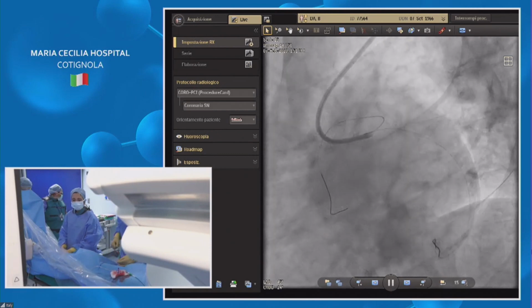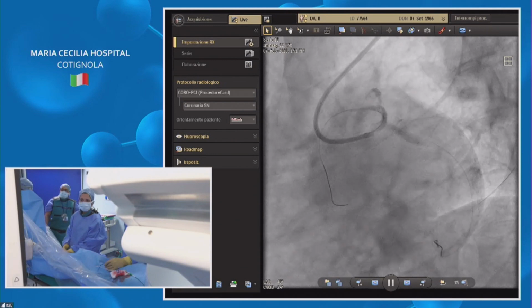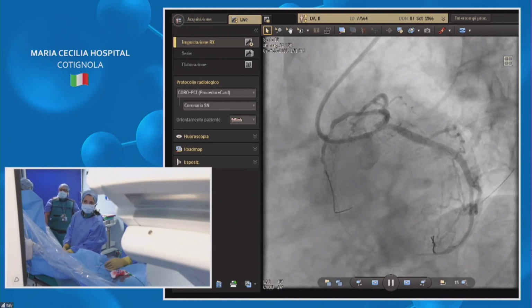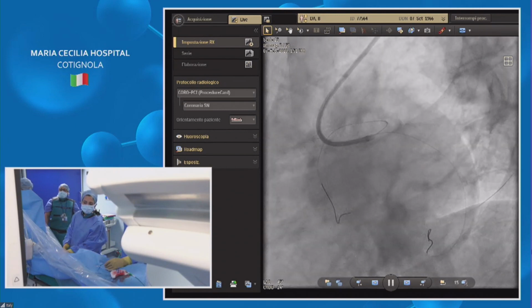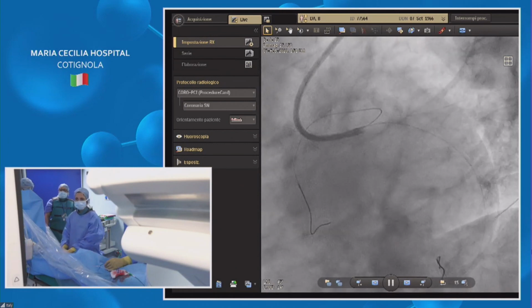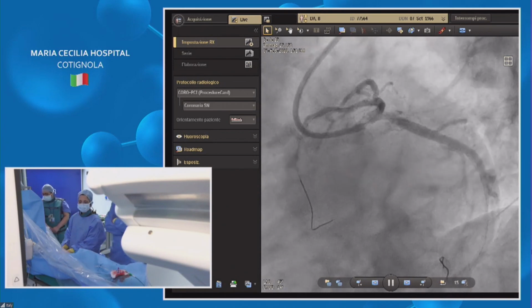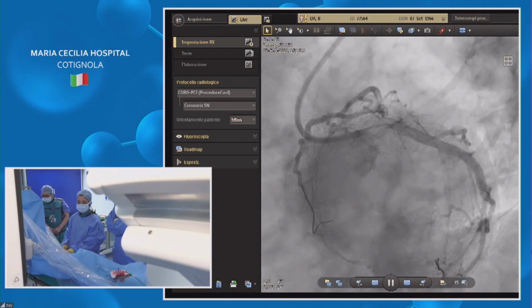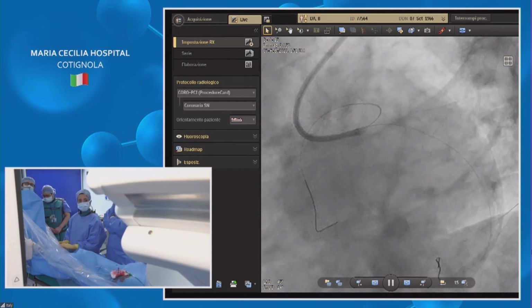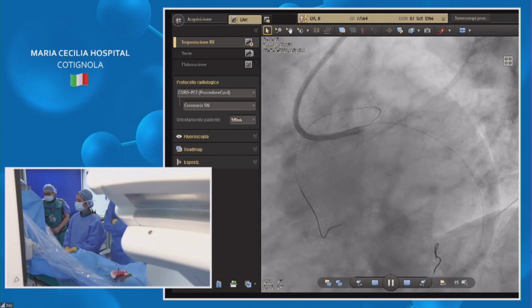I am not sure whether I would like to pull the stent into the left main because the bulk of the disease is in the ostioproximal LAD, and I think there is a reasonably good angle, which is about 90 degrees. So I think that we can land with a radiopaque stent with probably the marker on the proximal strut. We can probably do a pure ostial placement. We can ask the other colleagues. Suresh, what do you think?